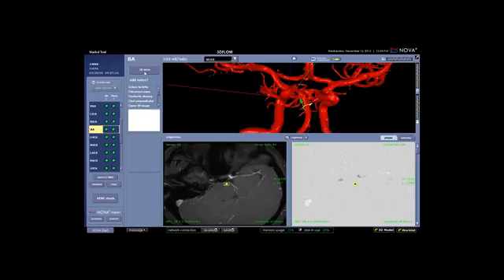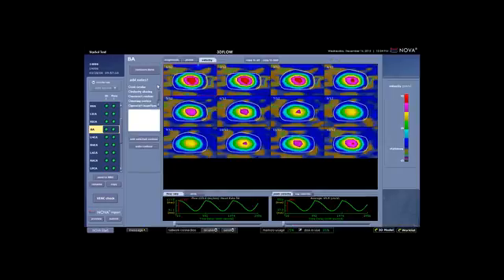So as you'll see in the next screen, we have available velocity contours. This is a cross-section of the artery showing the distribution of velocities in the lumen of the vessel. The highest velocity, maximum velocity, is red, and then these other colors represent diminishing velocities until you get out to the vessel wall where it's stationary tissue.